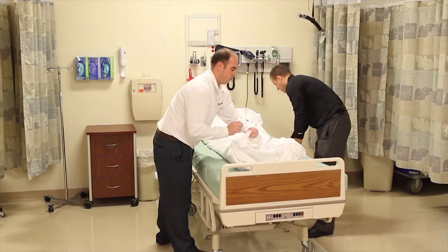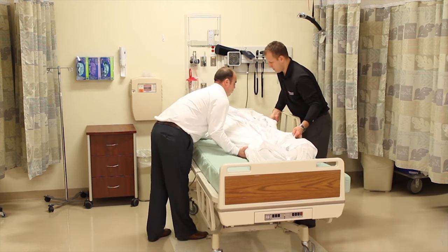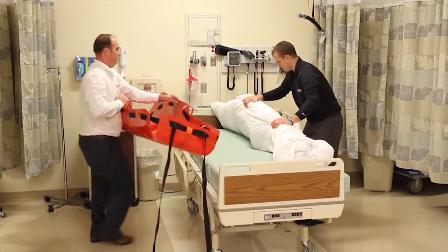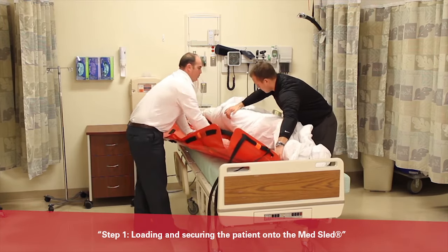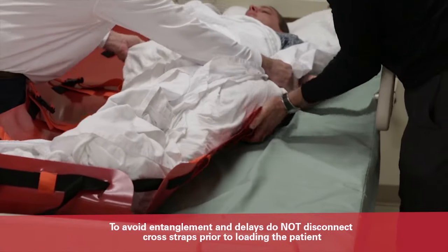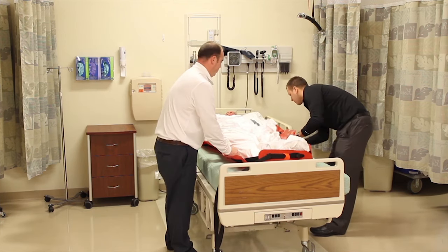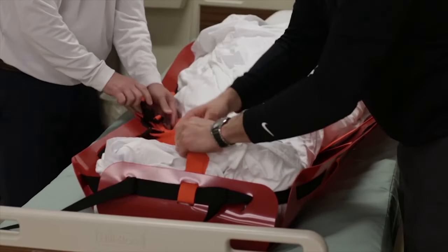The first step is loading the patient in the sled. To maximize comfort, wrap the patient in the bed linens. Once wrapped, raise the bed rail on one side of the patient bed. Utilizing the patient roll and pull technique, move the patient onto the MedSled. Prior to moving the patient, take note of their medical concerns. If a backboard or additional padding is needed, do so prior to moving the patient. Once loaded on the MedSled, adjust the patient so they are positioned at the bottom with their feet against the foot pad and centered on the sled. Lower the bed rail at this time.